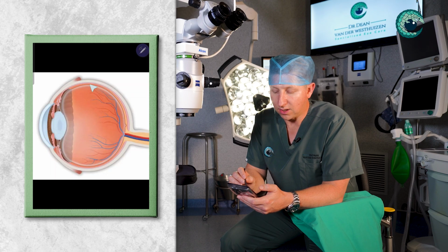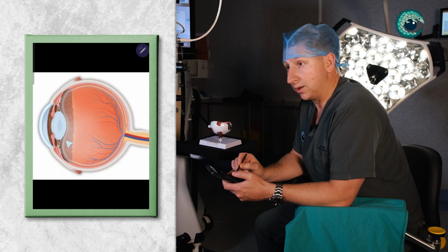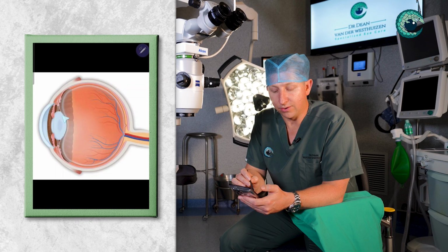And to access the retina, which is this layer at the back, whether there's a hole or a tear, an epiretinal membrane on the surface, or a macular hole that needs to be repaired, one has to first remove the gel in the eye. To remove the gel, we need to get access to the eye. We cannot access it through the front part, through the cornea, the lens and the iris, because we will cause damage to these structures.